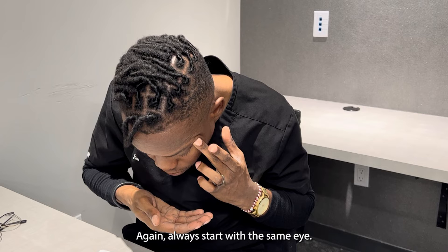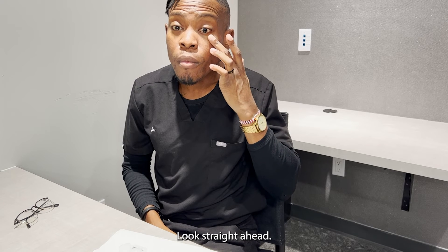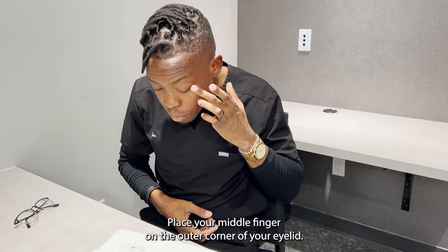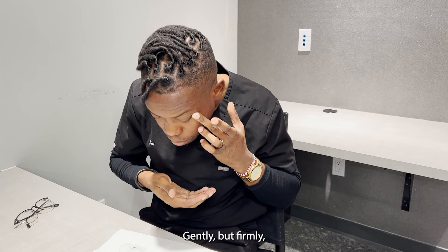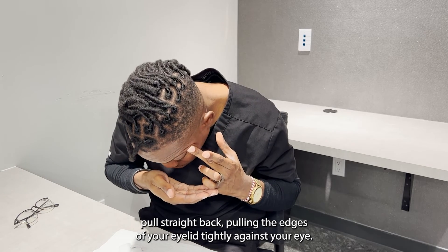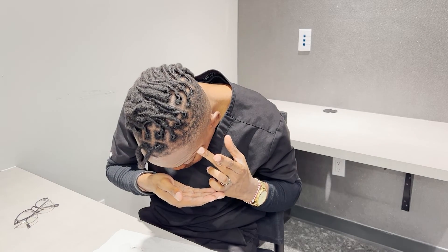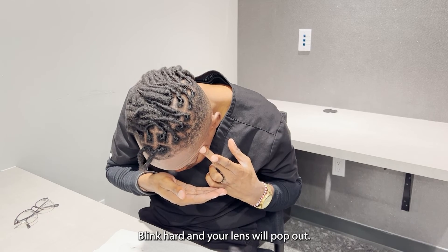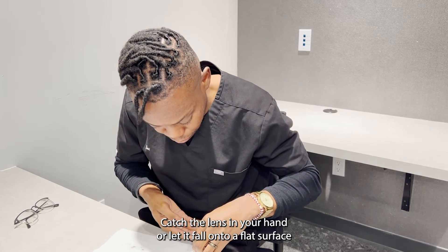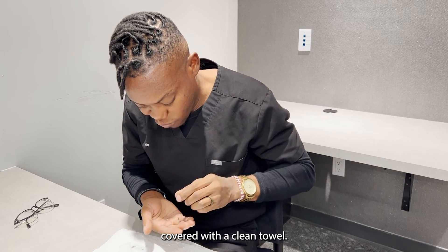Again, always start with the same eye. Look straight ahead and place your middle finger on the outer corner of your eyelid. Gently but firmly pull straight back, pulling the edges of your eyelid tightly against your eye. Blink hard and your lens will pop out. Catch the lens in your hand or let it fall onto a flat surface covered with a clean towel.